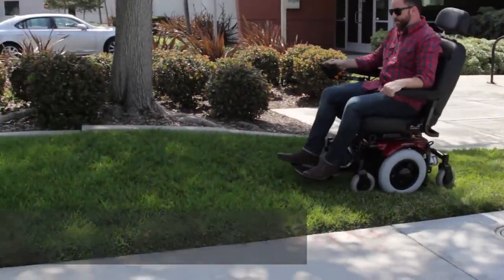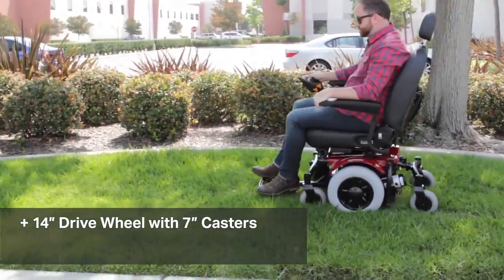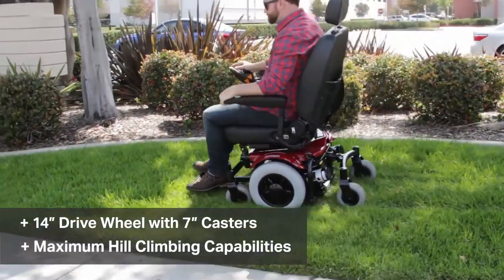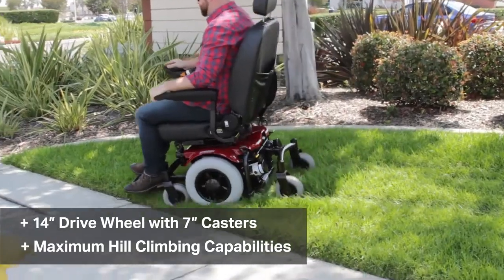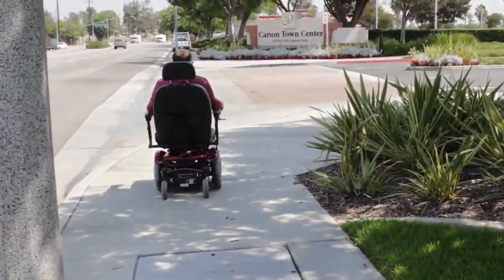The drive wheel assembly for this is a 14 inch drive wheel with a 7 inch caster. This offers maximum hill climbing capability and threshold climbing capability as opposed to smaller drive wheels and casters from some of our competitors' products.